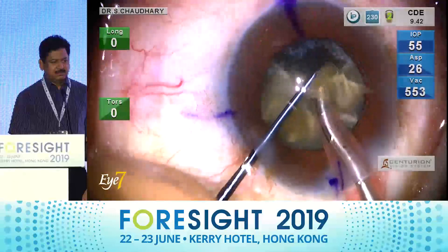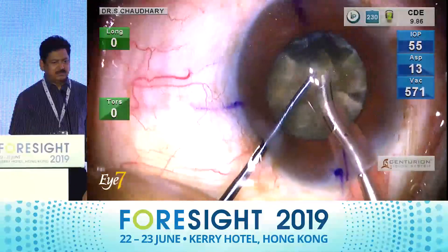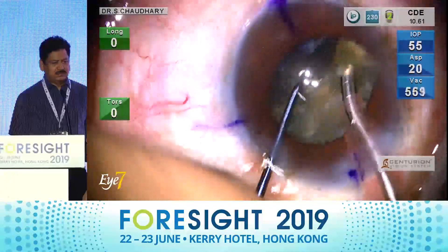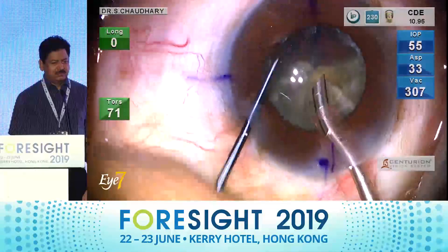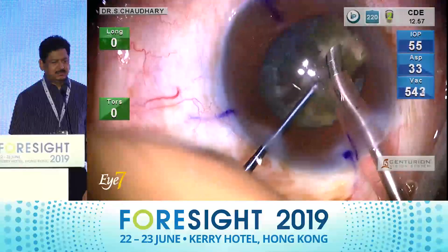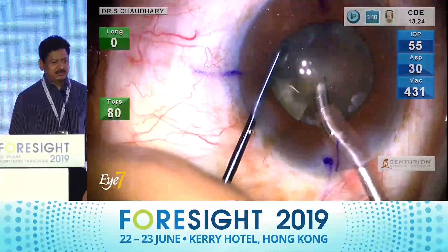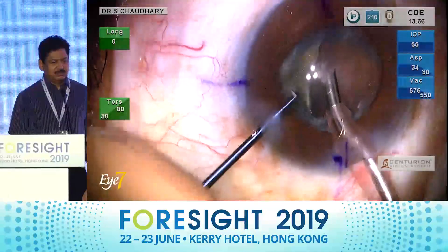The whole procedure of doing a hard cataract phaco emulsification appears so easy, comfortable, and controlled. And the phaco time, as you look at the top right corner of the screen, is just below 15 CDE, which is a good score for such a cataract.